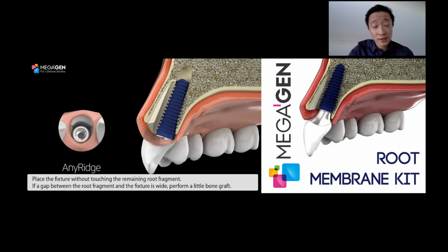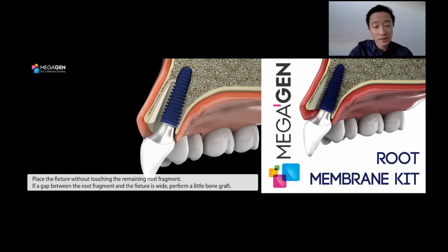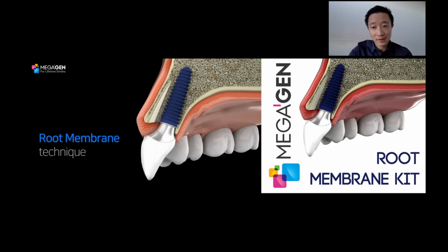Here you can see an any ridge implant from Megagen being placed to depth, slightly below the level of the shield and away from the shield as well, before a temporary is placed and healing commences.